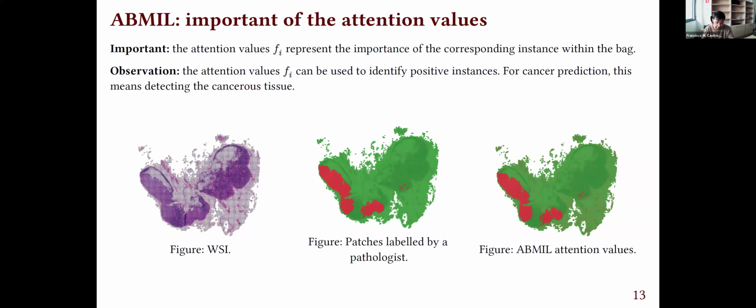It will be very easy thanks to, first, Trident, which will allow us to preprocess the slides, and second, torchmil, which will streamline the model definition, patch and whole slide image visualization, attention value predictions, etc. To end this first part, I would like to briefly introduce torchmil, but we are going to talk about it in the second part.